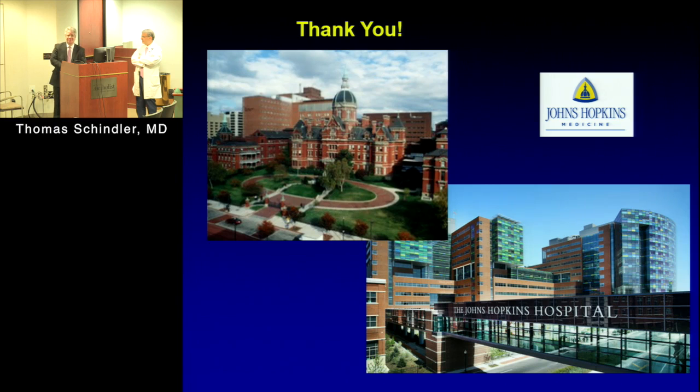There was one initial study where there was some weak correlation, but with few numbers, 10 years ago from New York. The problem is I think most centers didn't follow it up because they didn't have a large transplant program. So they did a few patients and then they dropped it for some reason. But I'm pretty convinced that in these patients the flow reserve goes down when they have rejection or develop transplant vasculopathy over time. Marcelo Di Carli, so I think it's maybe a good means of added value to see whether patients have rejection, because if they have rejection, the flow reserve goes down progressively. But we need data on that.